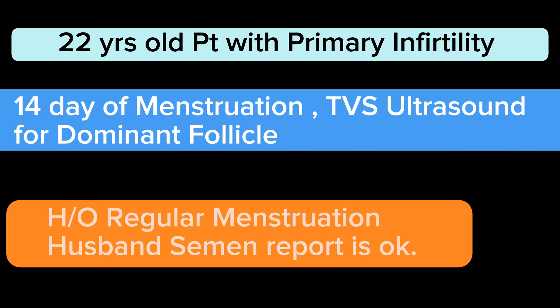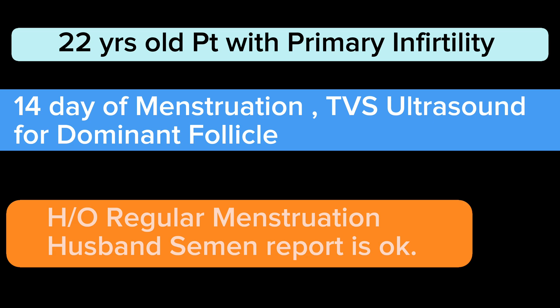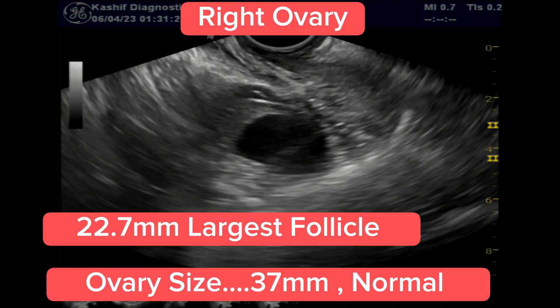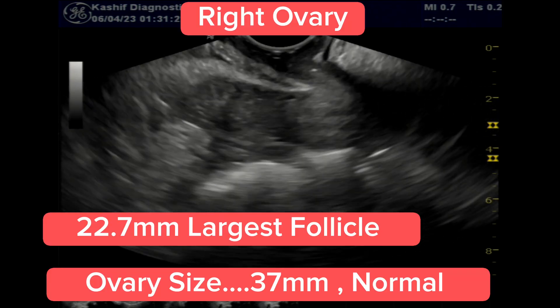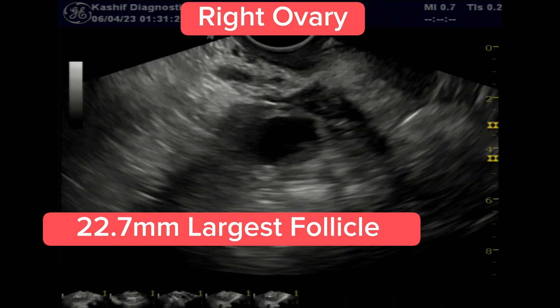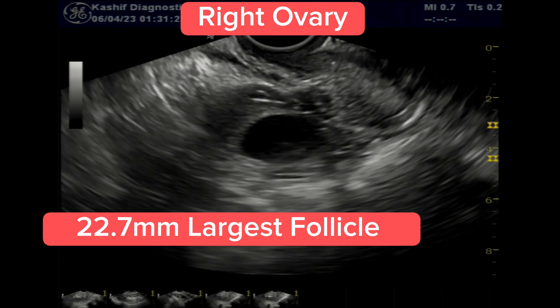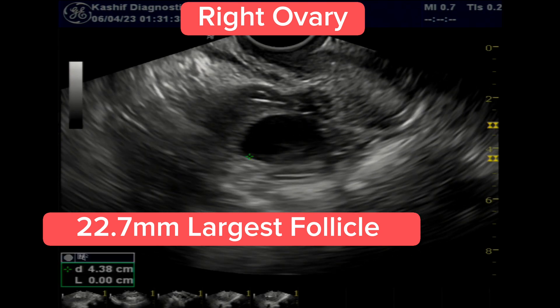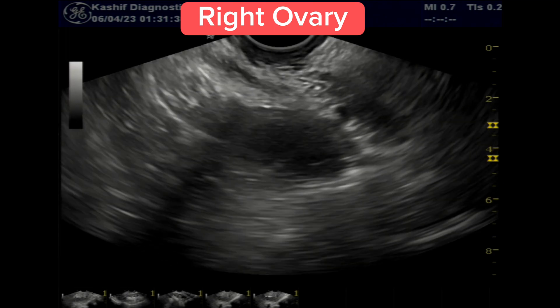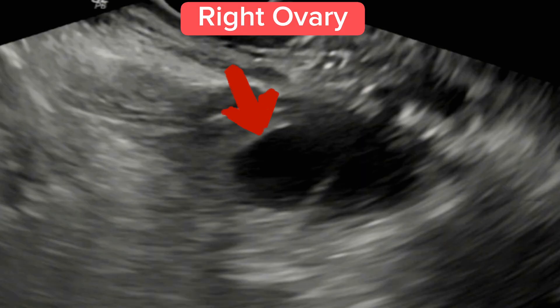This is a scan of a female patient, married for 10 months, with a history of infertility. This is a 14-day TVS scan for dominant follicle. The right ovary is visualized, normal in size at 37 millimeters. There is a dominant follicle of 22.7 millimeters in the ovary — this is a good follicle without any medicine intake.